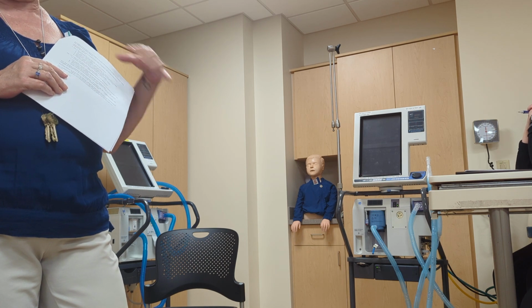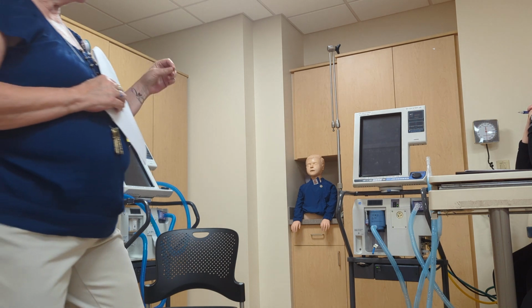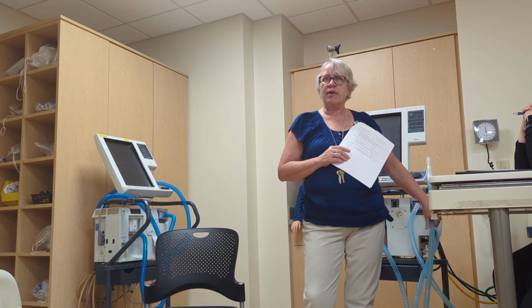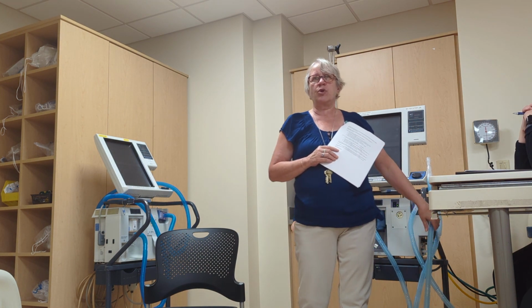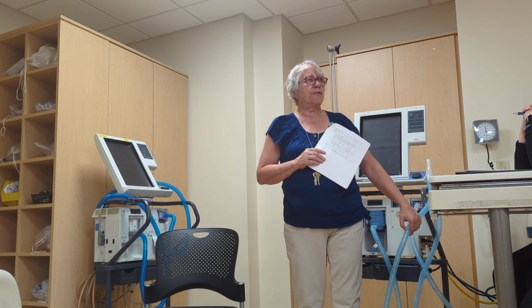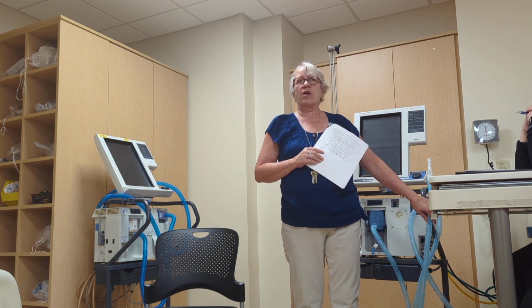You're going to learn how to calculate that, but that SST on these vents calculates your tubing compliance. So you want to see how much volume you're losing to your tubing. Well, as this stuff gets stretched out, I lose more and more volume. If I don't recalibrate, then I'm not going to be giving my patient the right amount of volume.